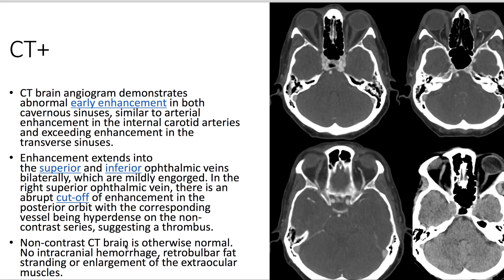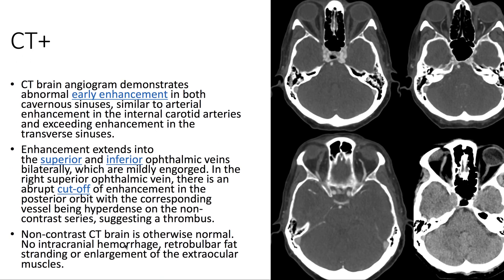On CT with contrast, we see that there's abnormal early enhancement in the bilateral cavernous sinuses. The enhancement extends here to the inferior ophthalmic vein, as well as to the bilateral superior ophthalmic vein.